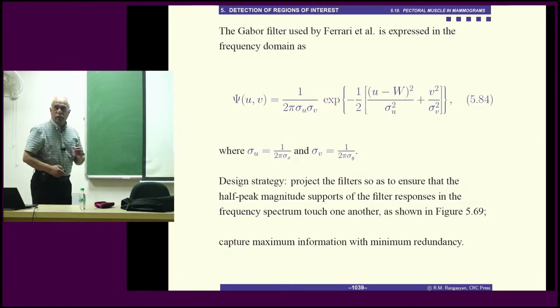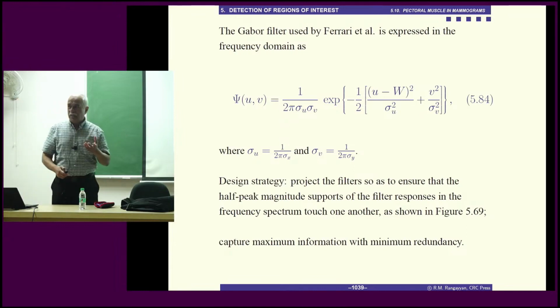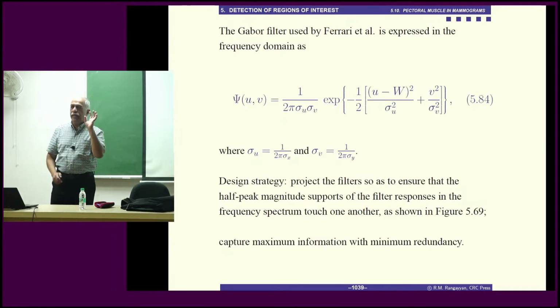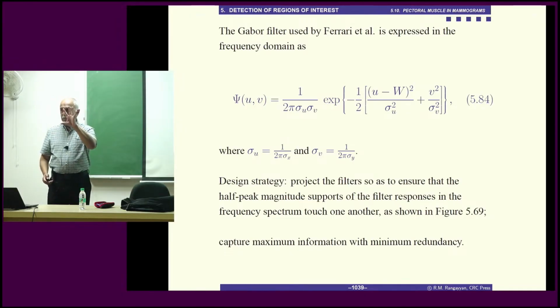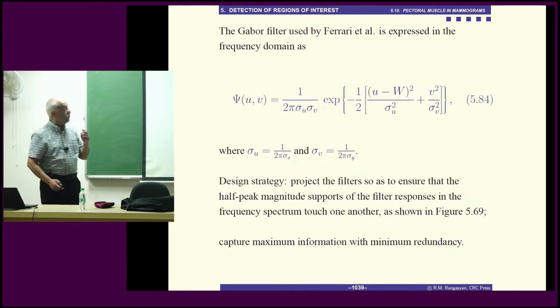In the frequency domain, you get bandpass filters. The Fourier transform of a Gaussian is a Gaussian. You are modulating it and rotating it. Rotation in the space domain is rotation in the frequency domain by a corresponding angle. And the scale factor will shrink or expand that Gaussian. And the modulation will place it at a certain position depending upon the modulating function frequency.